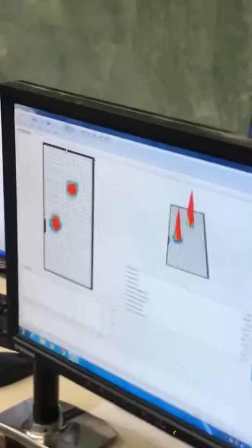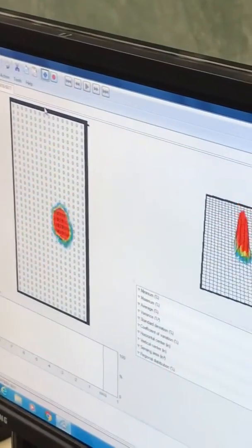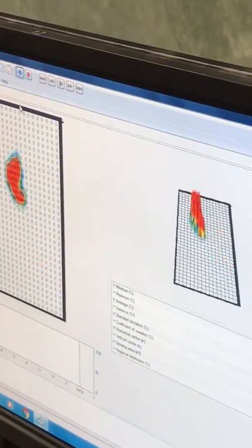Okay, so with regards to where the heel strikes and the toe strike, what's the relevance? You could do that if you're looking at orthotics. If you want to do dynamic orthotics, this would be the way to go, not static orthotics. At one time we did this for diabetics to look at where their pressures were during heel strikes. And you're using the sensor on your head to control the cursor on the bottom to hit the soccer ball.